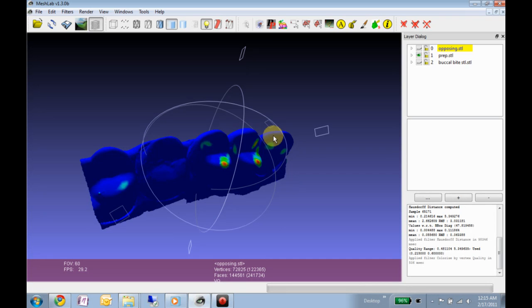How accurate this is is purely a product of how accurate each individual scan was and how well they've been registered together.